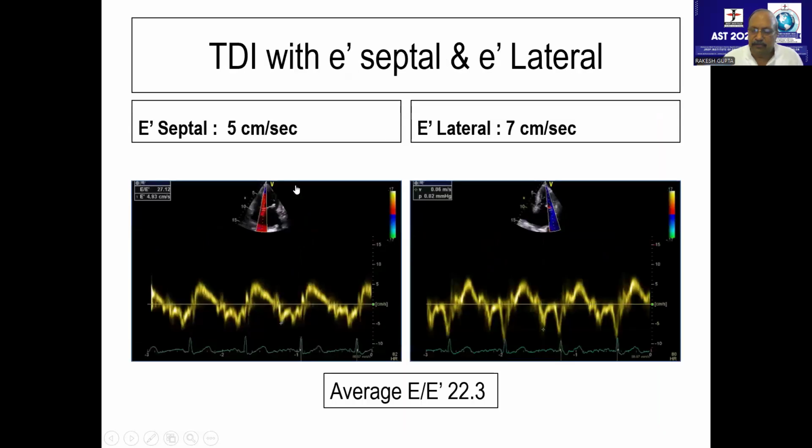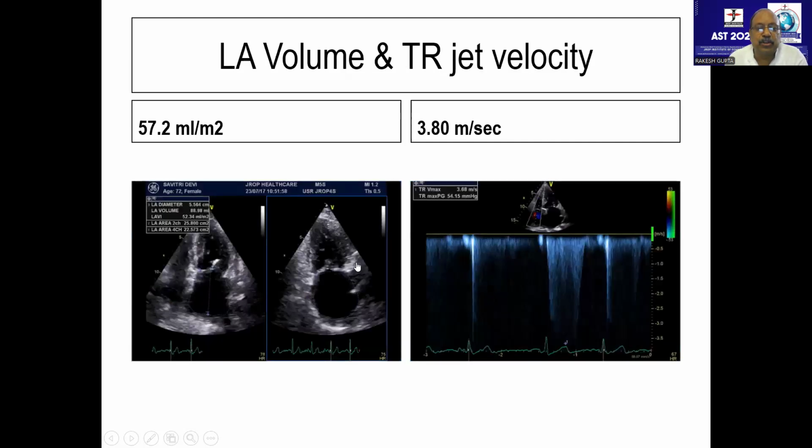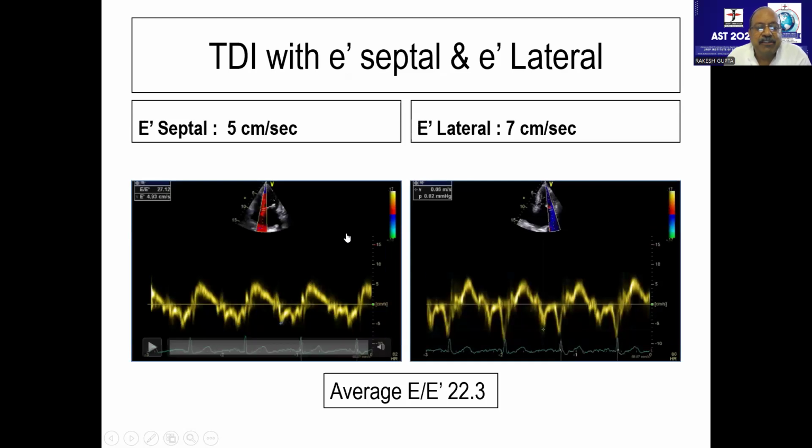Dr. Sanjay Mittal told you very categorically, and showed you a slide where he used a tissue Doppler image. Now, I'm sure talking about tissue Doppler imaging at this particular moment would be a little bit high, but nothing wrong about it. We put a tissue Doppler imaging. What is this tissue Doppler imaging?